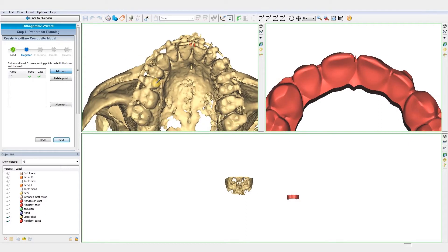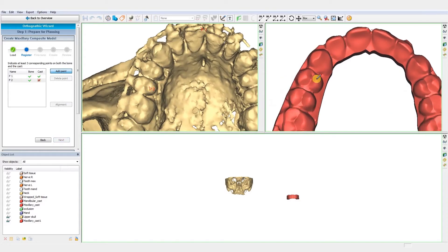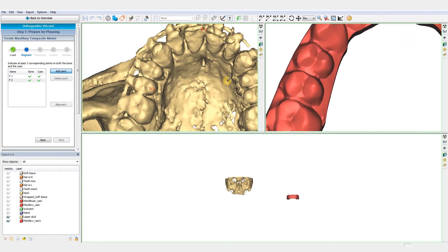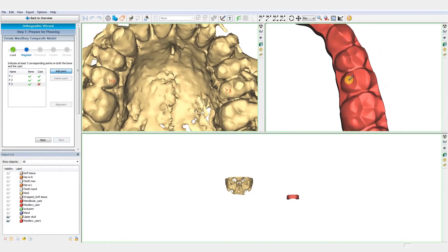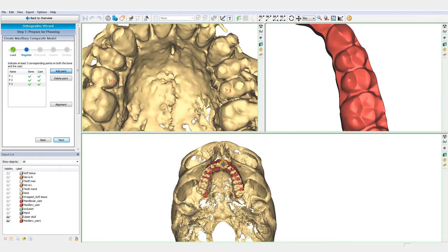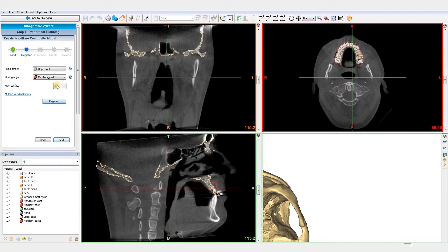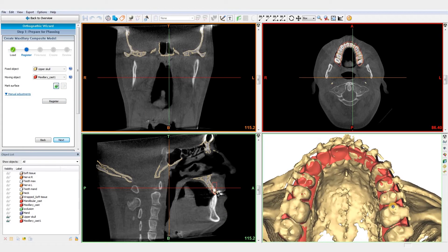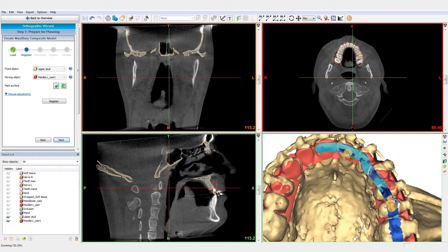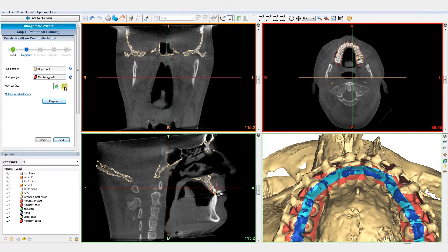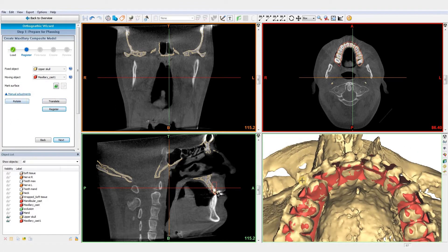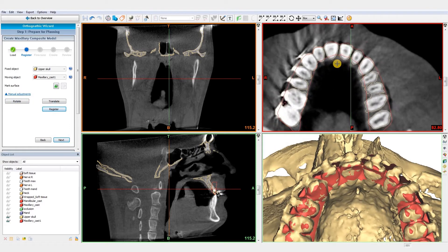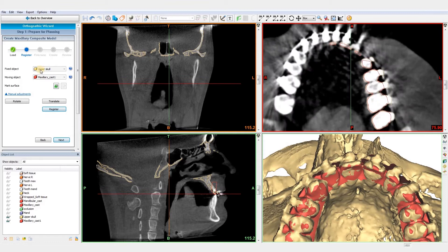We will start with the maxillary composite model. In order to merge the maxillary cast and the CT model of the maxilla, we will register both parts. This is done by choosing identical points on both the maxillary cast and the CT model. After the registration, you can double-check the outlines of the casts and the CT model on the CT scan. You can fine-tune the registration if necessary.